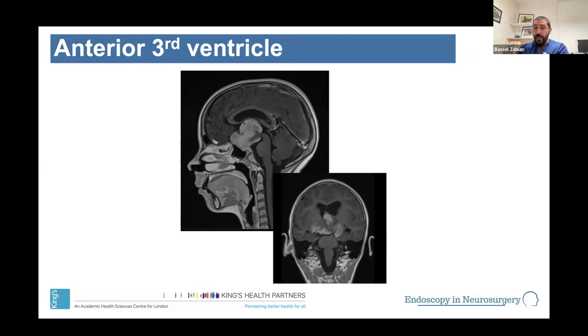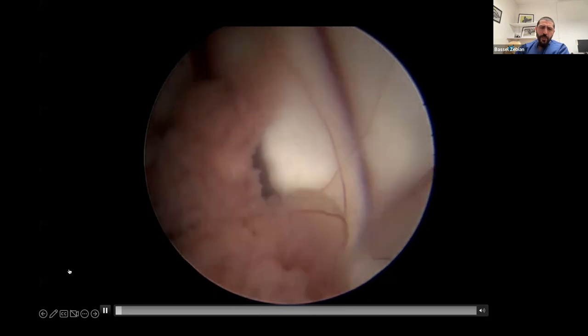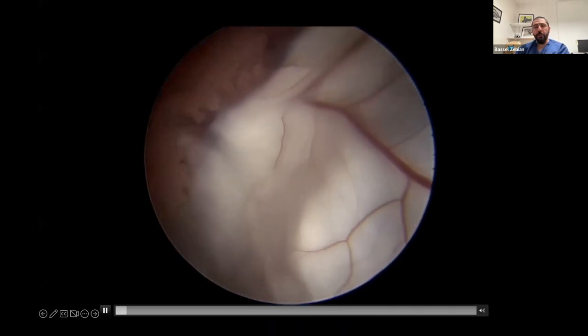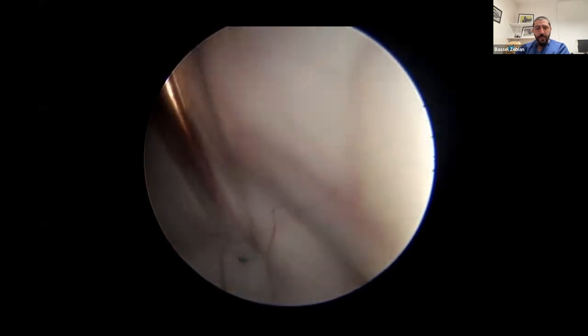So the majority of patients will have chemotherapy with these. She's had those three lines of chemotherapy and it was still growing. So they really were keen to see if there's any targetable mutations, but also her ventricles started going up and she started blocking off. And we thought, can we go in and debulk and get some pathology? And this is one of the more recent ones, I think, in the last 1 or 2 years, and just shows the choroid fissure splitting quite nicely, I think.